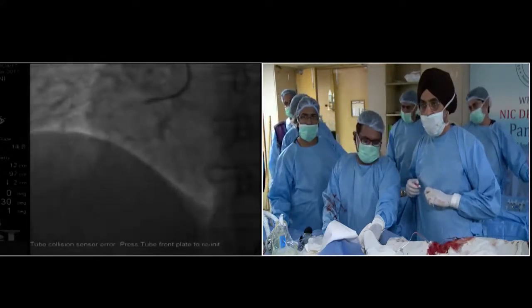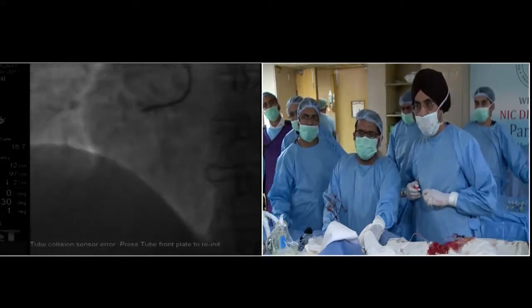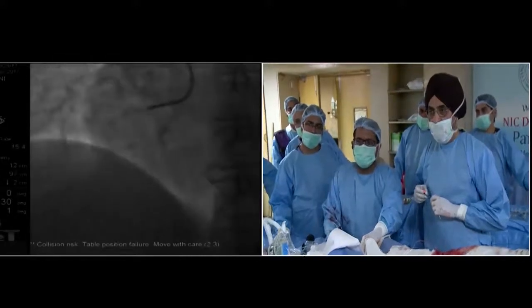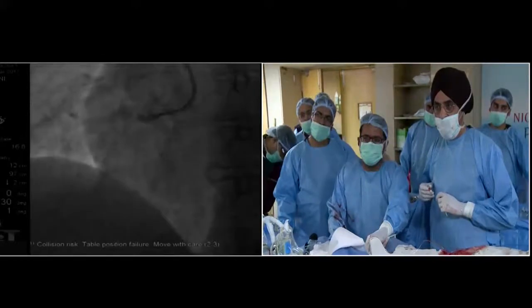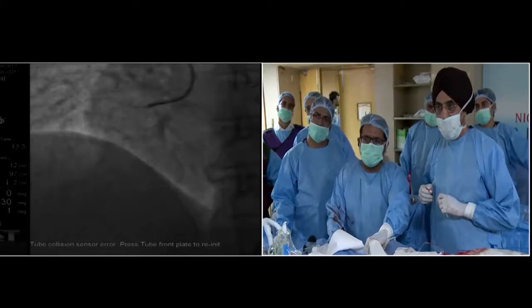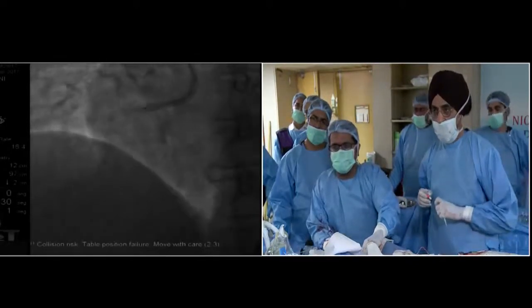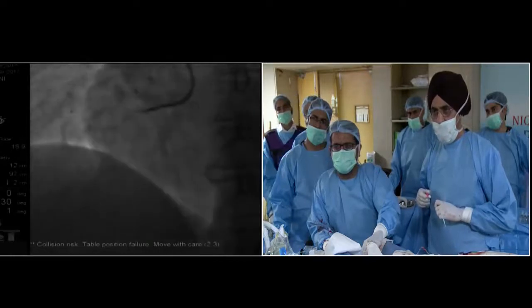While you're working, can you give us an idea about the antiplatelet regimen that you have done for this patient? Yeah, she's on aspirin and clopidogrel. And we had a good discussion before about the use of antiplatelets in acute coronary syndrome, and this patient seems to have an unstable angina. Do you have any preference, or this is what is available? So the ticagrelor should have been the choice, but she's already loaded with clopidogrel, so I didn't disturb it.